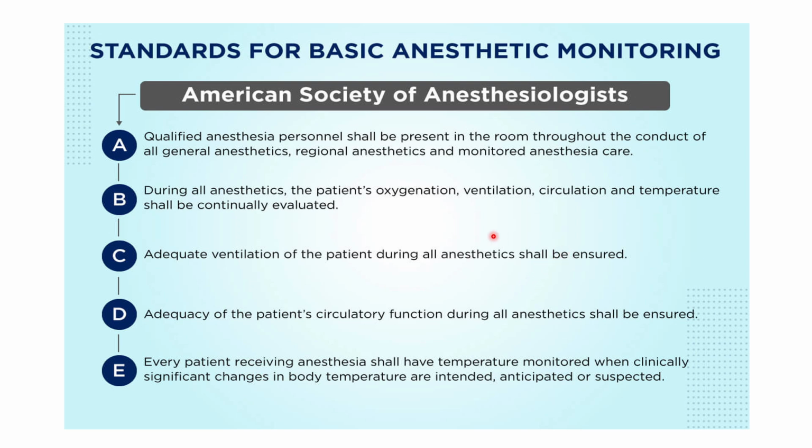To know the difference between ventilation and oxygenation, we can talk about the operation of a laryngeal tumor removed by laser. At this time, we remove the endotracheal tube, and while the surgeon is working, if he is not going to use the laser at that moment, you can provide an oxygen line to the patient, which will diffuse passively for oxygenation.